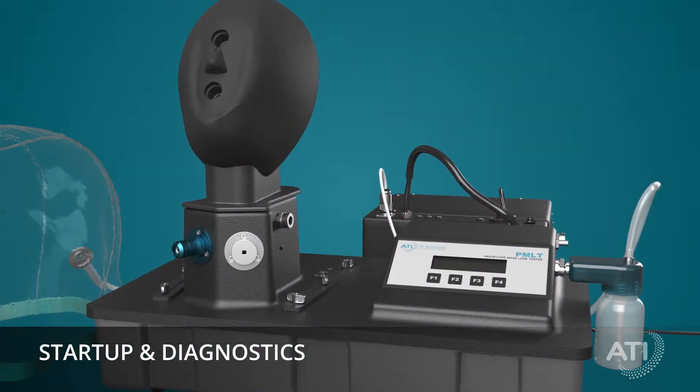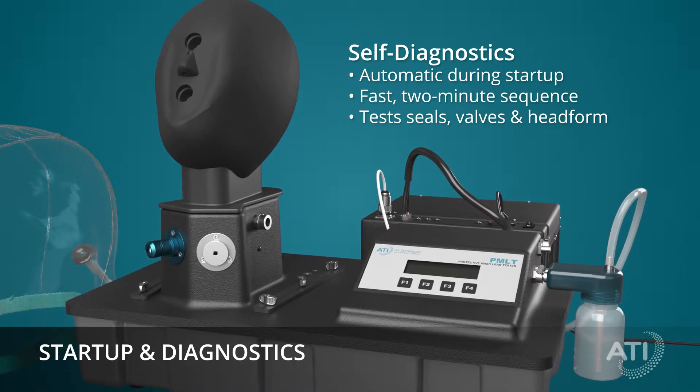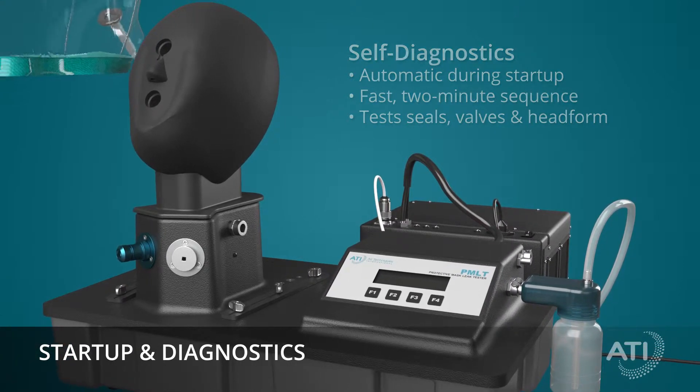The PMLT performs self-diagnostics while starting up. This two-minute self-diagnostic test ensures internal valves, seals, and the head form are functioning properly.